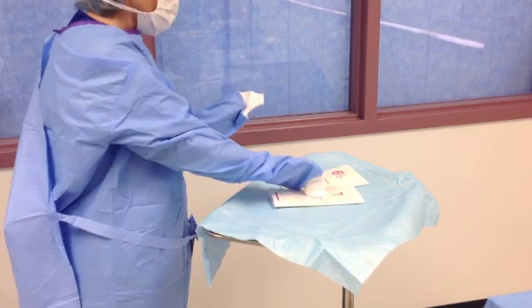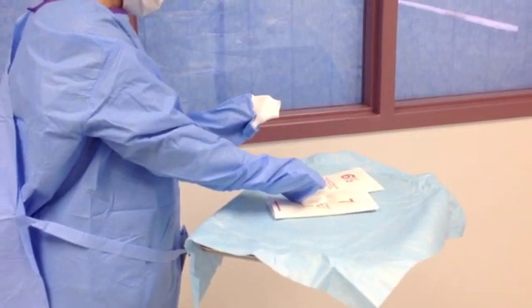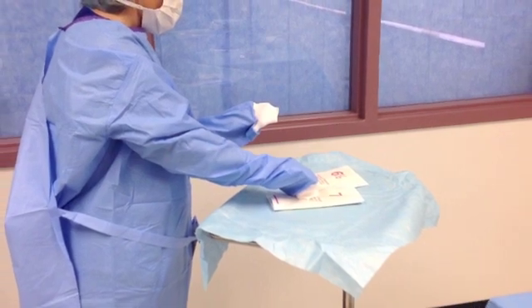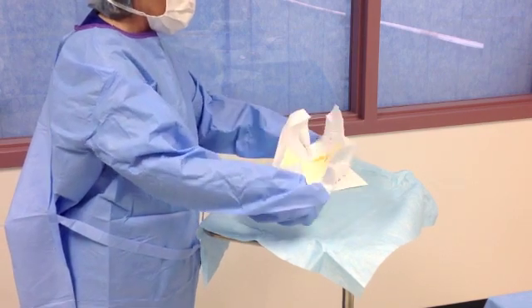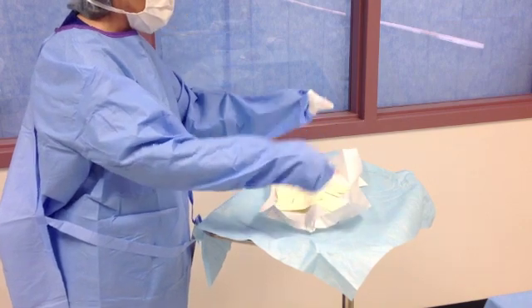Begin closed gloving by grasping the appropriate glove package with your cuffed hands. Do not let your fingertips extend through the cuff opening at any time. Open the gloves just like you would open a book. Keeping your hands cuffed, grasp the two center edges staying on the outside of the package. Pull the package open and pop it to keep the package in the open position.